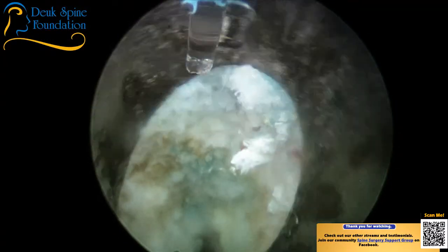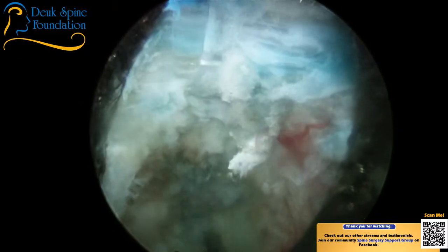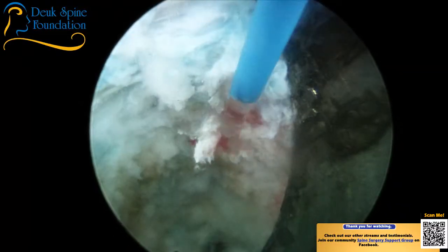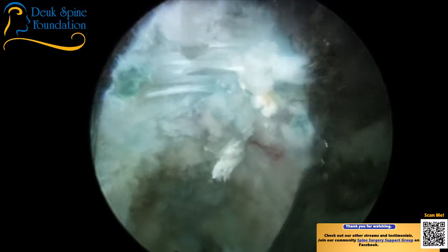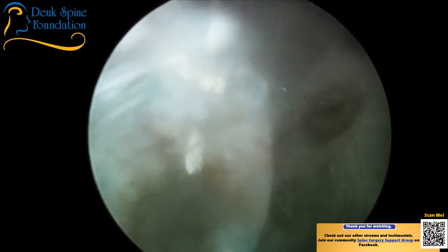All right, we're finishing up L4-5. You can see a lot of inflammation. That's the end plate right there of L4. You can see those white fibers are starting to become a ligament.